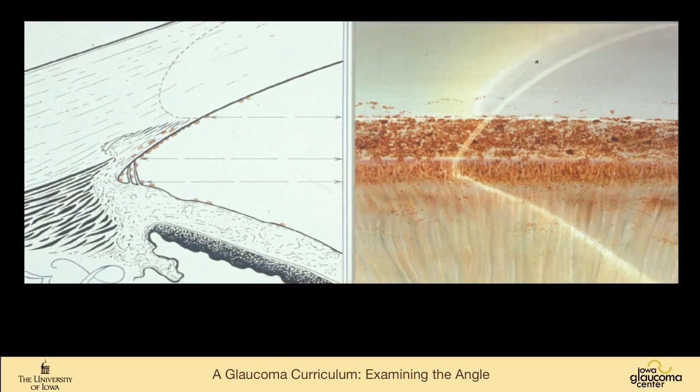This patient has a deeper insertion. One can see that it inserts into the ciliary body face. Here's scleral spur, a lot of pigment here. So this is a D because it inserts into the ciliary body face, 50 degrees. Again, this is flat, 4+ pigmentation, D50F4.